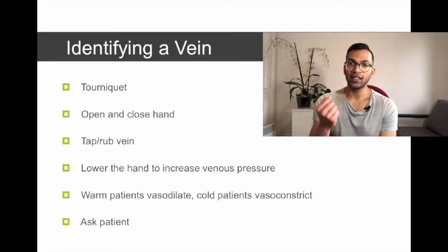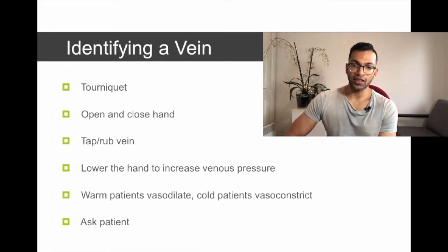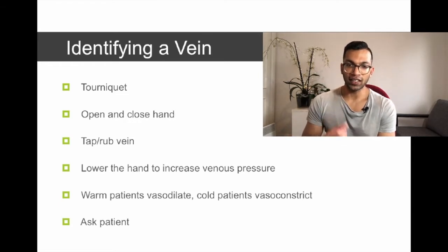So make sure that the hand is below the patient's heart, and this way you make sure that you maximize the use of the patient's own hydrostatic pressure due to gravity, and that helps to vasodilate as well.